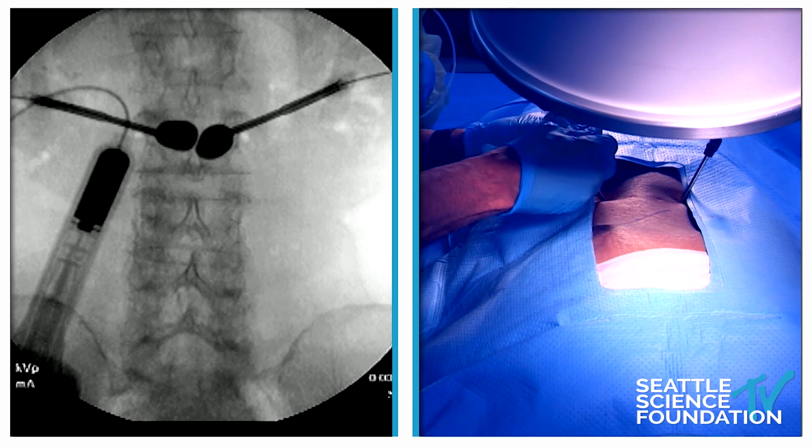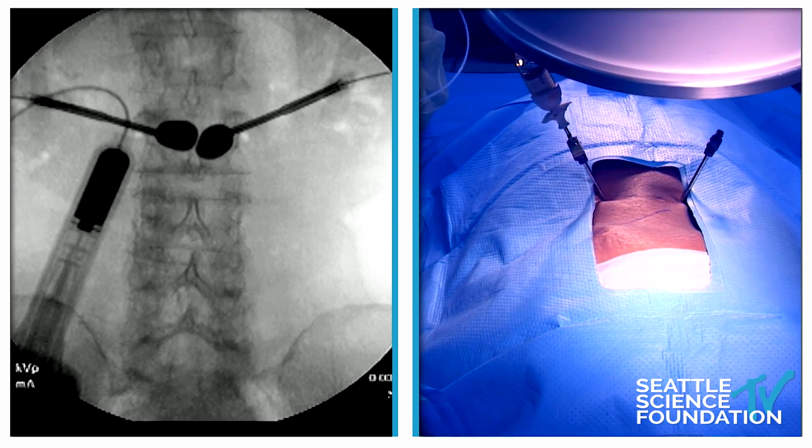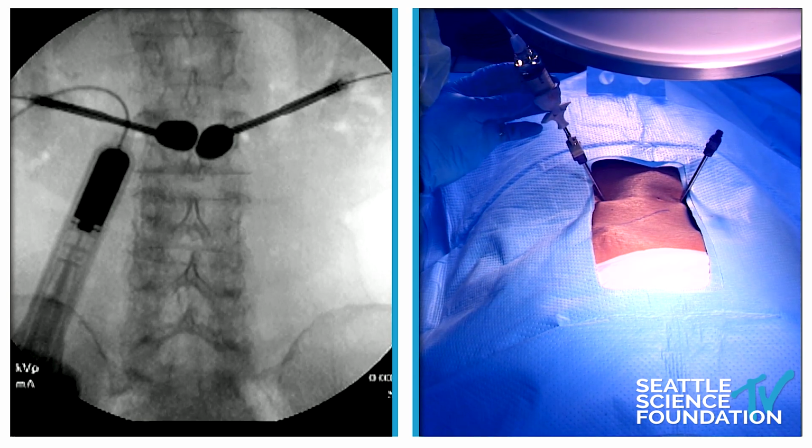Thanks, Doug. Go ahead. Yeah, good. So we're hooking up the cement to this, and this cement and the cartridge is X speed.